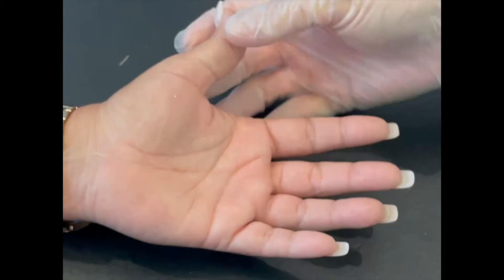In this patient, we're going to be injecting the left ring finger. There are two lines that are going to help us decide where to inject. The first line is the palmar distal flexion crease, which is defined by this dashed red line in the palm of the hand. The line marks the metacarpophalangeal joint.